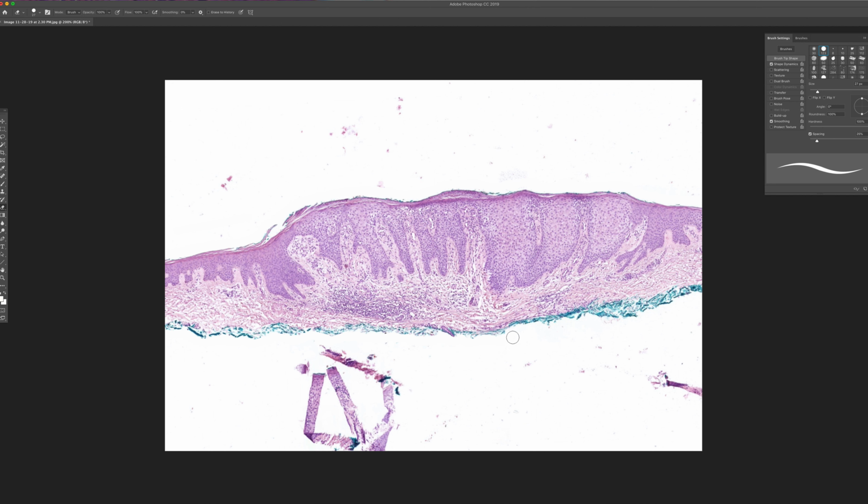And that's something that I'd recommend to you all. It takes a little bit of extra time, but it's always very useful to ink the bottom and the sides of a specimen so that if it turns out to be something troublesome, you can tell whether the lesion has been fully excised or not. Now that's the edges of the lesion, and now we can move along a bit more quickly.